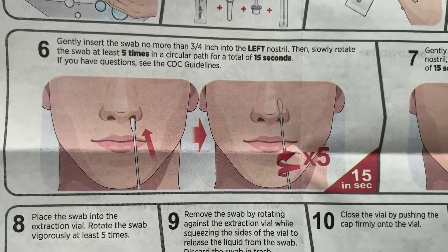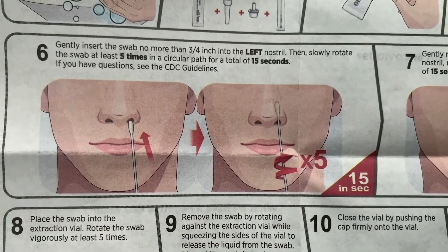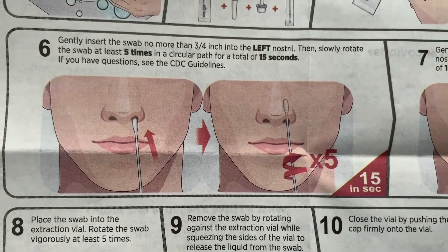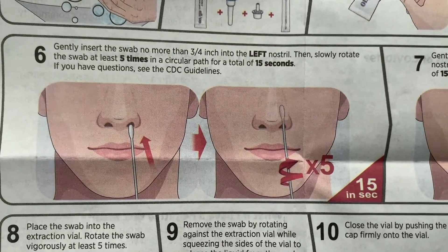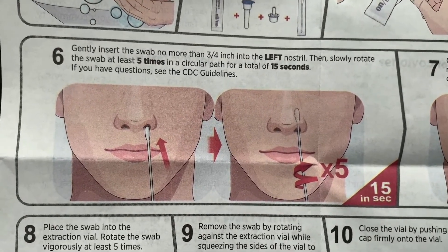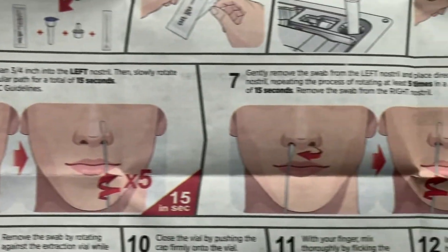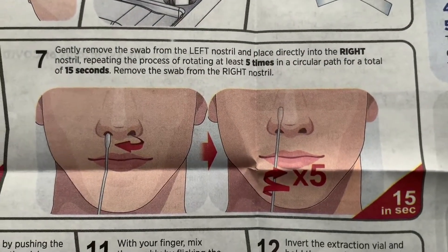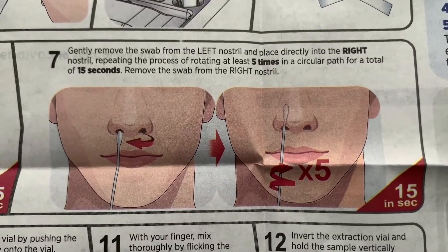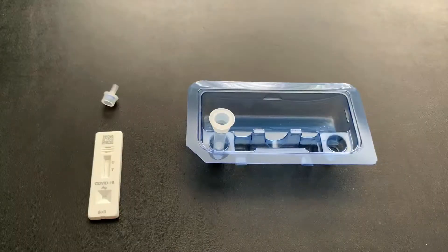I'm going to spare you having to watch me insert this into my own nose. Go ahead and gently swab inside your nostril — start with the left, slowly rotating the swab at least five times in a circular path for 15 seconds. Then move the swab over to the right side and do the same thing: rotate at least five times in a circular path for 15 seconds.